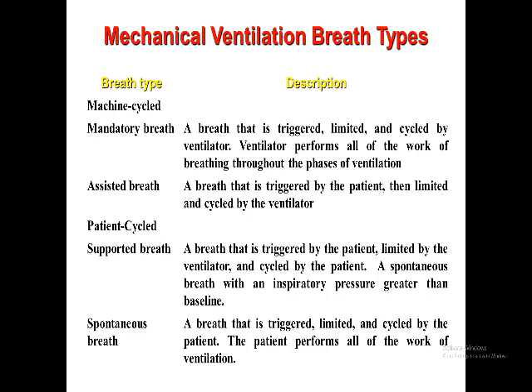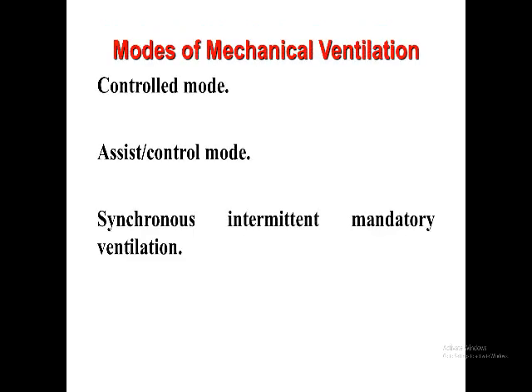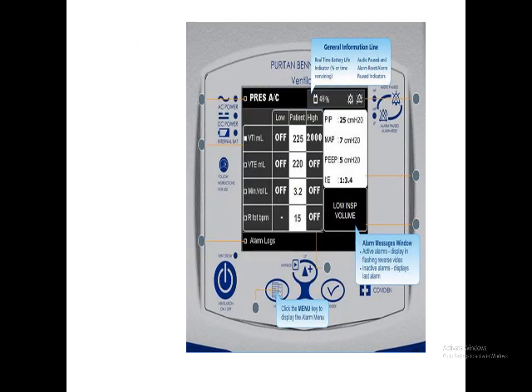Mechanical ventilation breath types. You have to read it. Mode of ventilation, either controlled mode or assisted controlled mode or synchronized intermittent mandatory ventilation or pressure support ventilation.